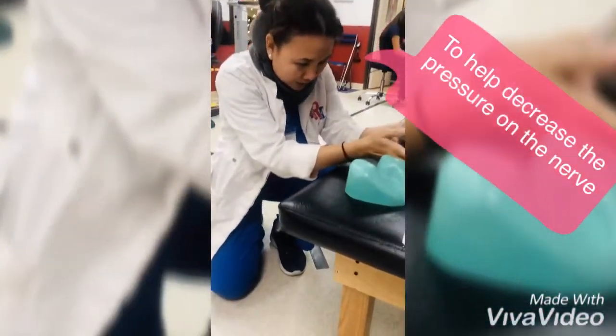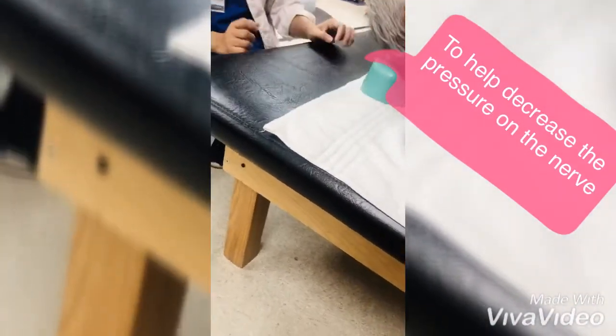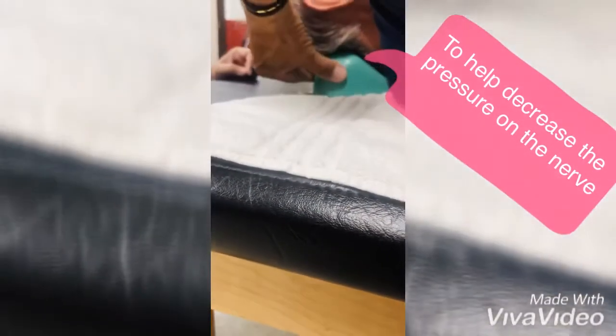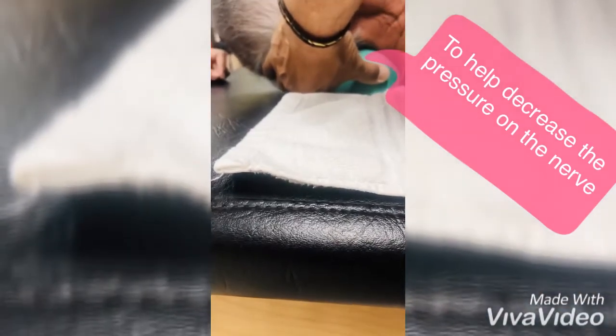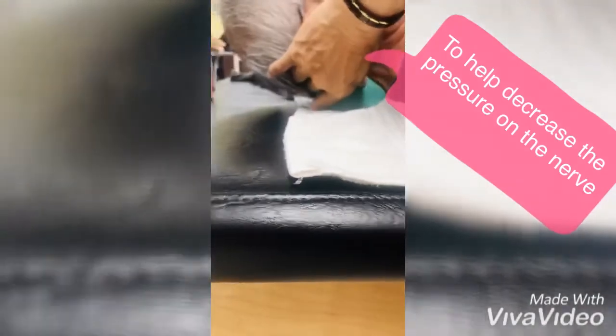I'm going to have our patient move his head up and find his spot — find your trigger spot. He's going to adjust, and once he finds his spot, he's going to try to relax his neck muscles. We're going to make sure that his shoulders and neck muscles are relaxed.